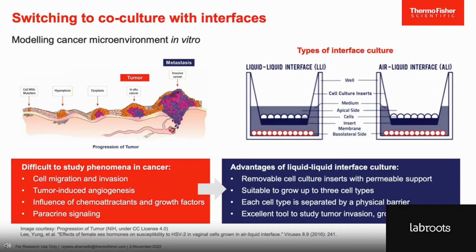Typically these interface cultures are classified into two types. The first one is liquid-liquid interface culture, which is the most widely used in many applications. And the second one is called air-liquid interface culture, which is primarily used in modeling the respiratory cells of the lung.